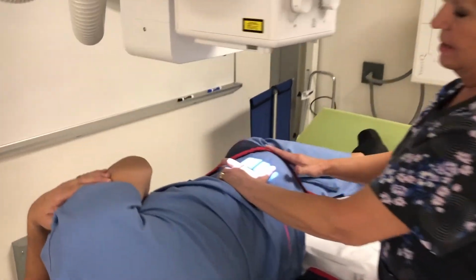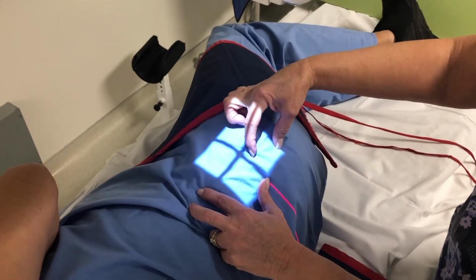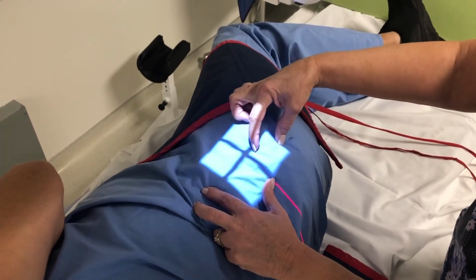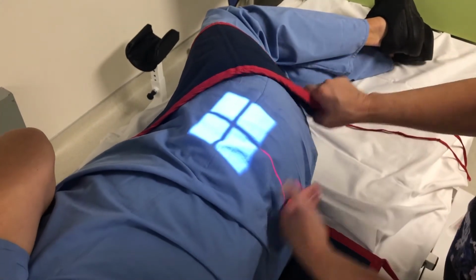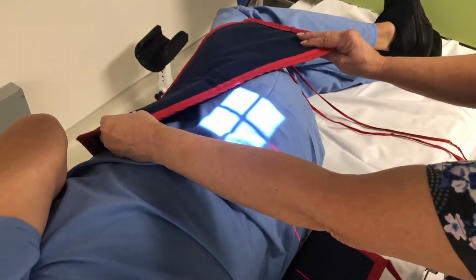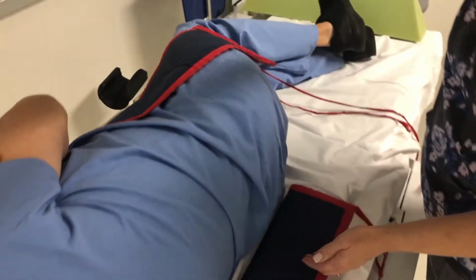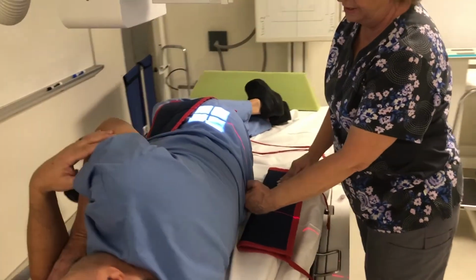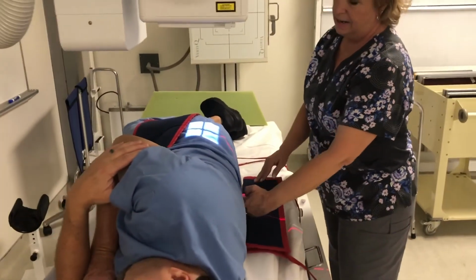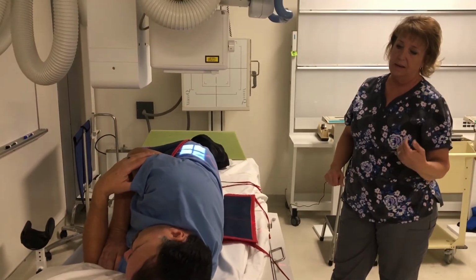So I think that would get his L5 and his S1 right in my small field of view here. Okay, so I can shield anteriorly. Again, this is very thick body part, so I would want to put my lead shielding posteriorly to absorb scatter, and I would have him suspend breathing and expose.